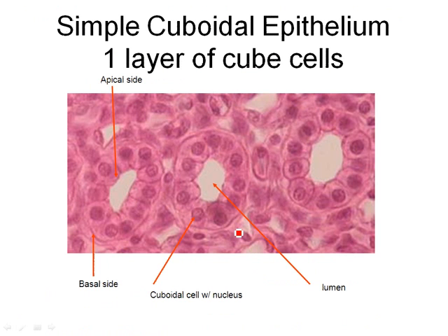Alright, now this one, these are simple cuboidal epithelia. So what does that mean? Simple means one layer, right? Cuboidal means those squarular. That's what I like to say. They're kind of square-shaped cells. So you have a single layer of these squarular or cuboidal cells. So one layer of cuboidal cells, simple cuboidal epithelia. The stuff between is basically connective tissue.